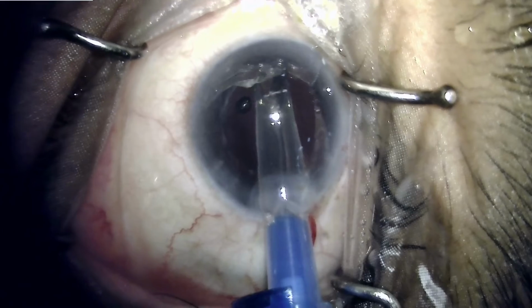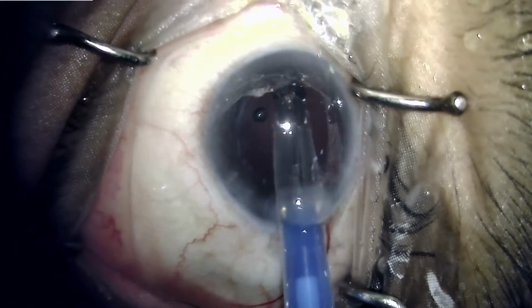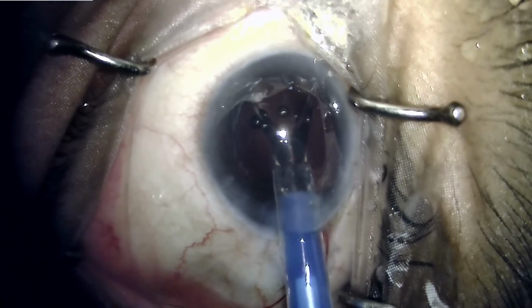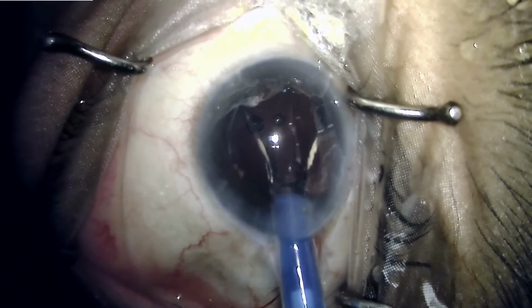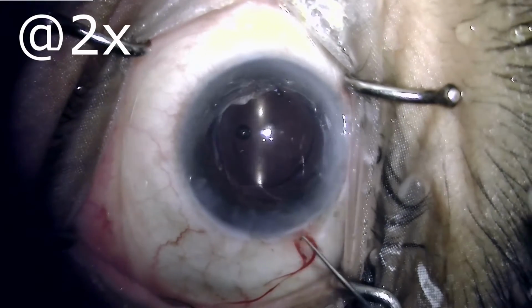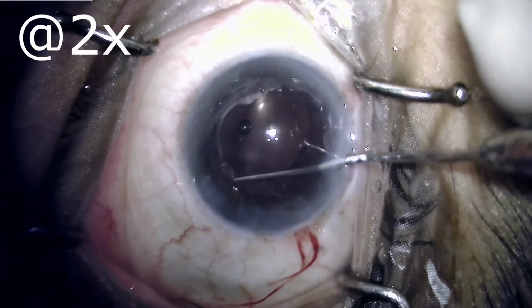And it's important to take care that the leading haptic goes directly into the sulcus, otherwise if this leading haptic prolapses into the YAG capsular opening, then the IOL may dislocate into the vitreous cavity. The leading haptic has been placed in the sulcus and the trailing haptic is being dialed.